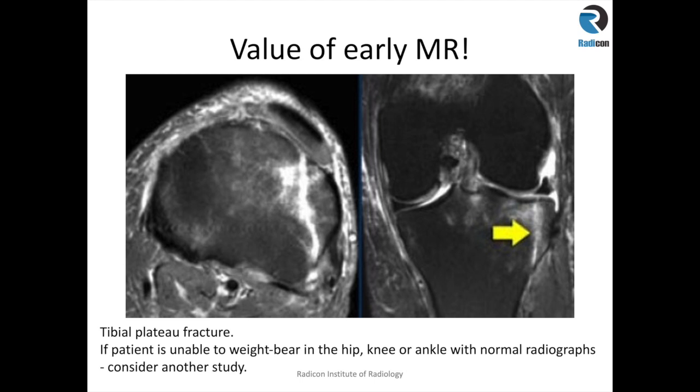This demonstrates the value of getting an early MRI, because non-displaced or micro-trabecular fractures can be difficult to diagnose on plain radiographs until they become displaced or the patient becomes more symptomatic. It is important to recognize the full extent of injury early so that appropriate treatment can be planned. Please consider doing an early MRI, especially if the x-ray is unremarkable but the patient is still in significant pain, discomfort, or is unable to weight bear.